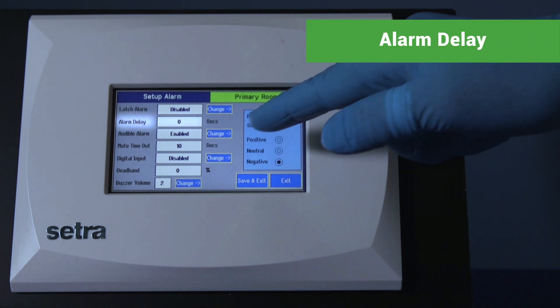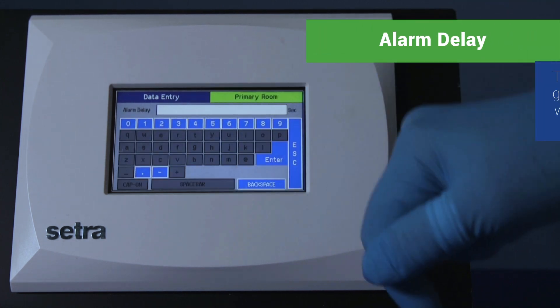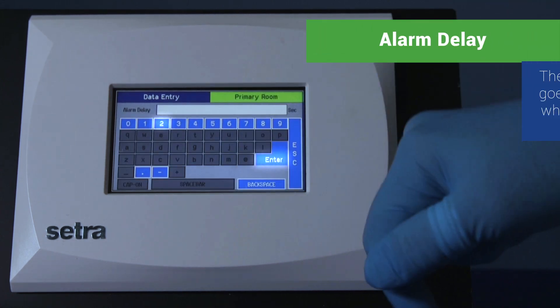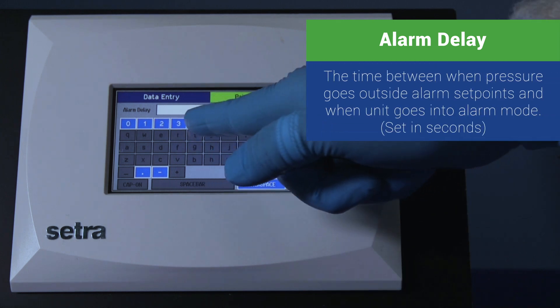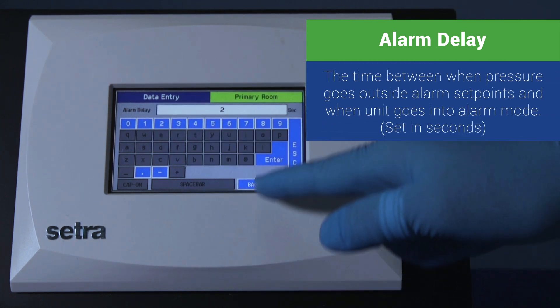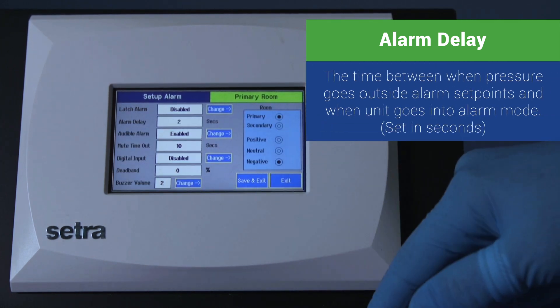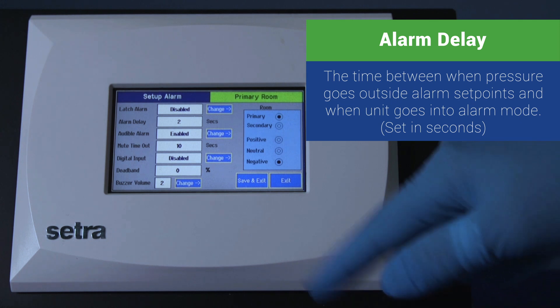Alarm delay: the time between when the pressure went outside alarm set points and when the unit goes into alarm mode.